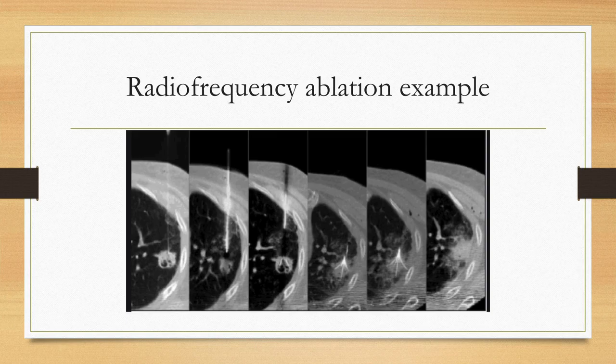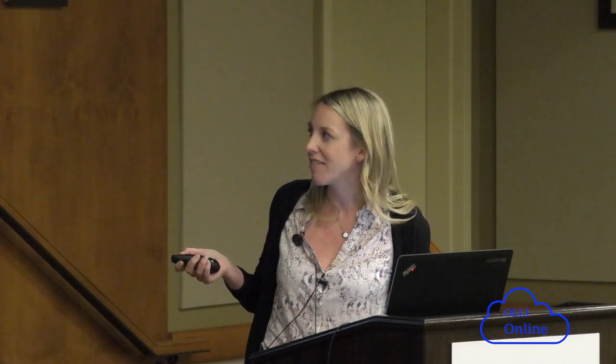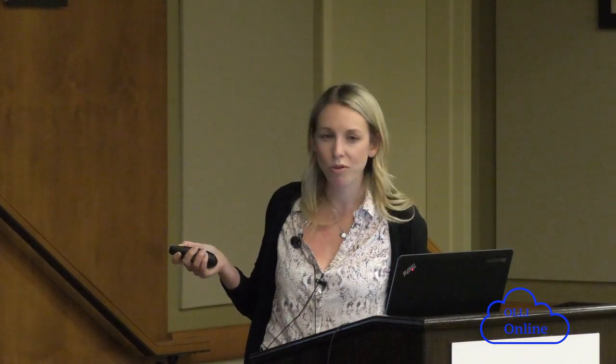That's actually exactly what you want to see. That's a good response. So the whole area was treated. You see this kind of puffy area around it. That's the tissue around it reacting too. So that's a good response. And these patients will go on to be monitored after the treatment to see how it looks.